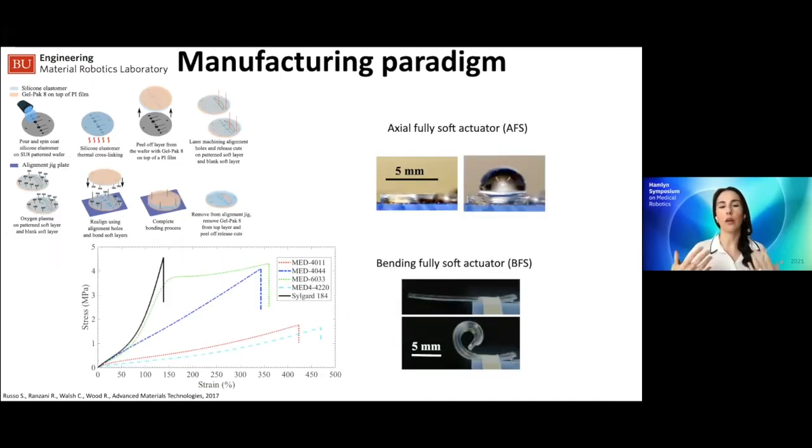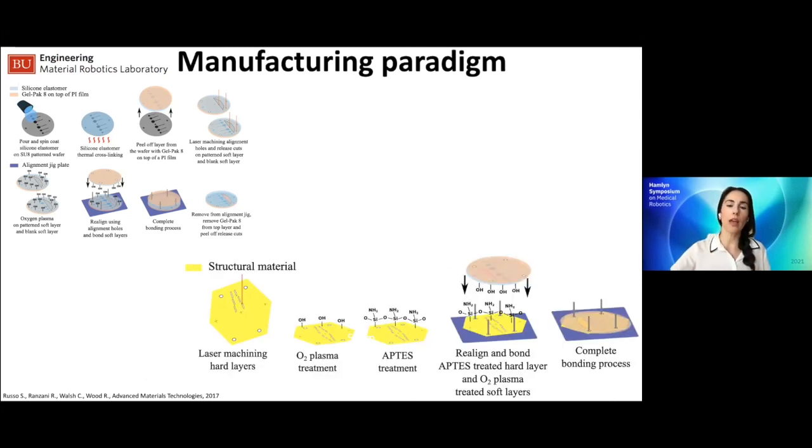soft lithography, PDMS-like materials. We have done a little bit of research into a variety of different materials that are biocompatible for realizing these soft robots, and they are also more stretchable than PDMS, so they can basically actuate at lower pressures and perform larger deformations at relatively low pressures to build the actuation part of those robots. And so these are fully soft micro actuators, basically, that we then bond to rigid substrates, and those can be plastics, metals, whatever really you desire.